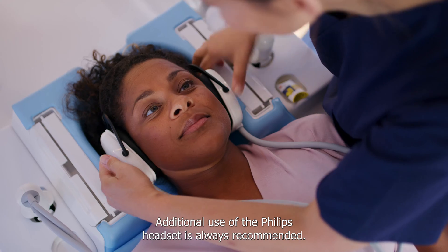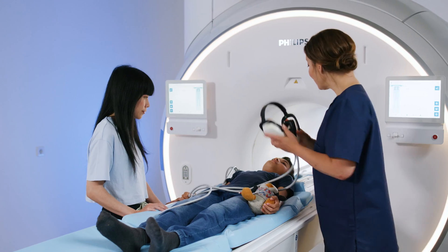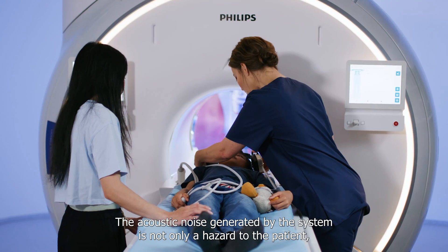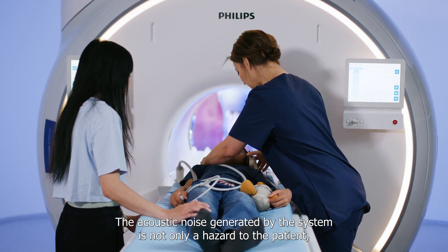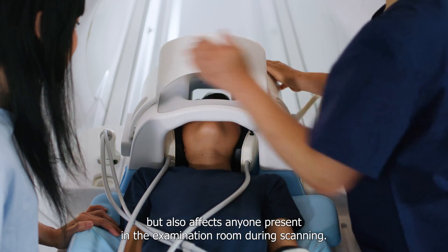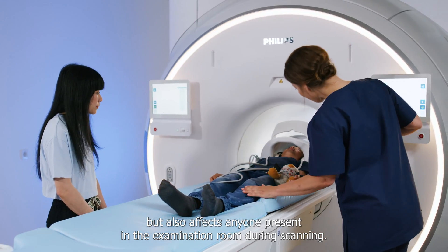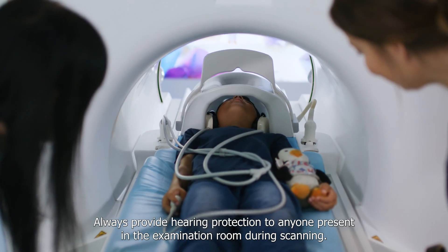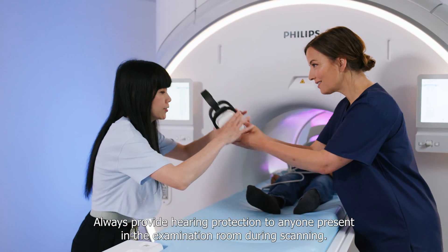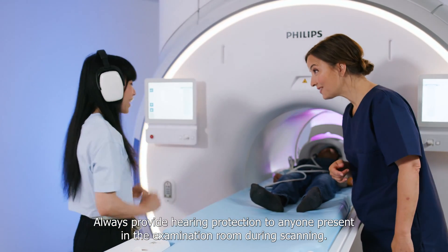Additional use of the Philips headset is always recommended. The acoustic noise generated by the system is not only a hazard to the patient, but also affects anyone present in the examination room during scanning. Always provide hearing protection to anyone present in the examination room during scanning.